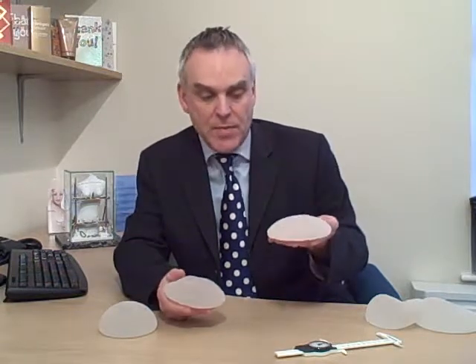So once we've ascertained the right base width, then we need to make a decision. Do you want a very natural appearance, in which case you'll go for a medium projection? Do you want a more rounded appearance, in which case you go for a full projection? Or do you want more dramatic, which is the extra projection?